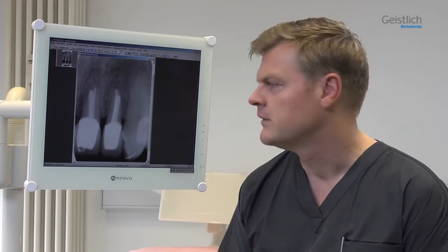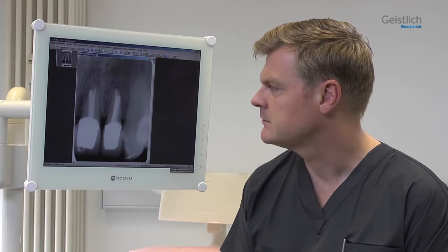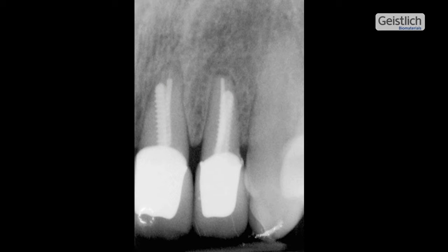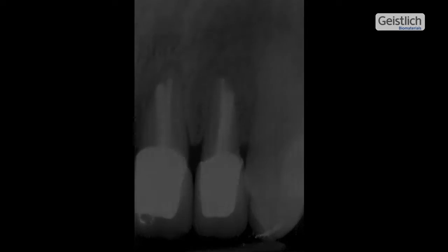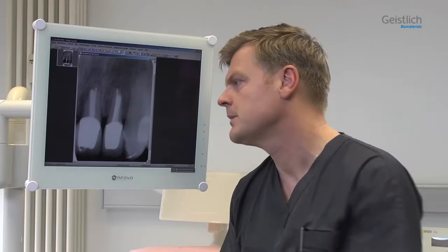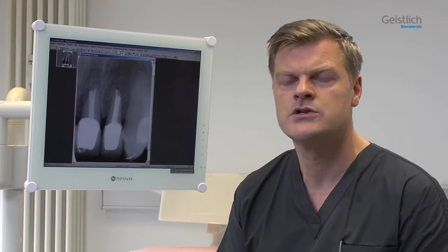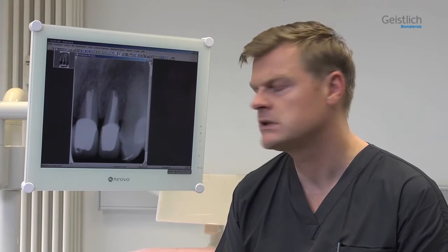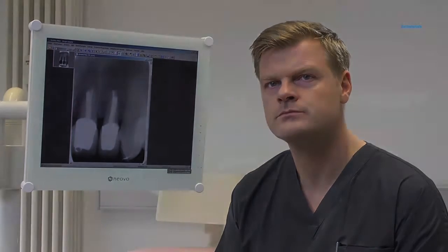We plan to remove this tooth and to close the gap with a single tooth implant. In the present intervention, we will extract the tooth, fill the socket with a bone substitute material, and additionally cover it with a collagen membrane. With this method, the volume and soft tissue contour will be preserved by a procedure known as ridge preservation. Successful ridge preservation makes later surgical interventions easier or avoids them altogether.